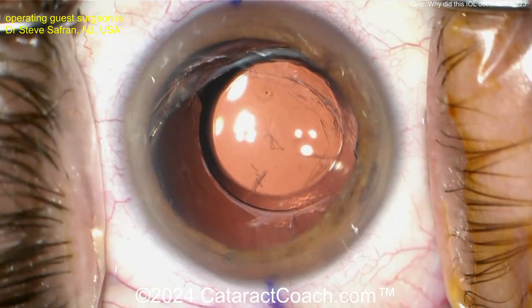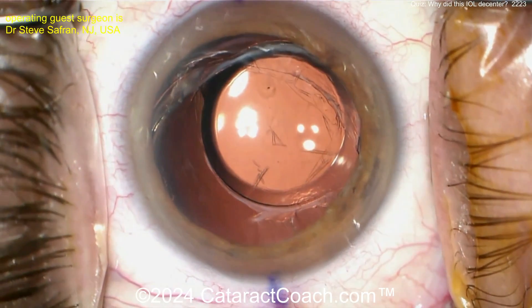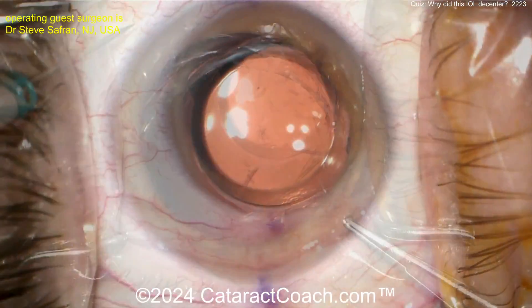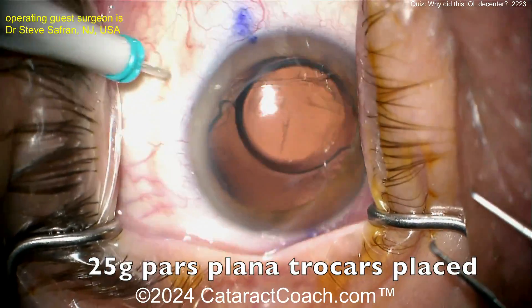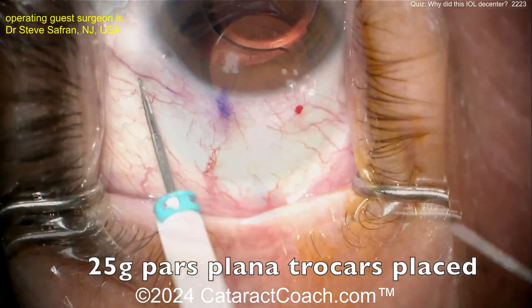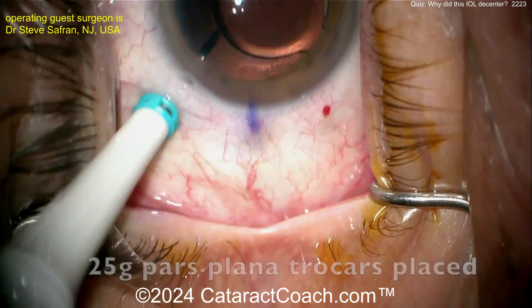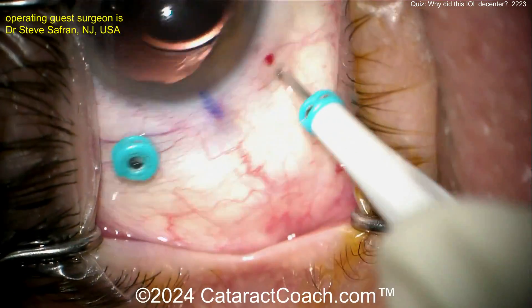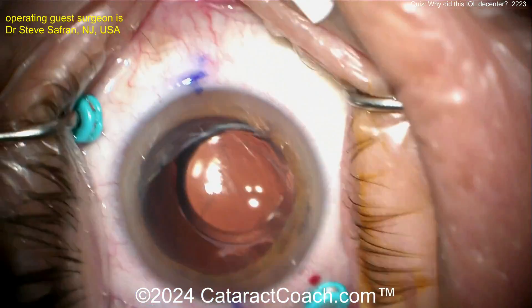It's already had a YAG laser capsulotomy done, and there's some glare from the debris. Our guest surgeon is master surgeon Dr. Steve Safran, who does these all the time. He's going to do a full pars plana vitrectomy to get rid of all that floating debris and floaters.